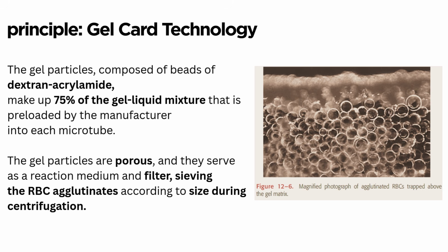So the gel technology plays a crucial role in blood testing by utilizing the properties of gel particles, which are made up of, again, what? Dextran acrylamide gels, or beads. And these beads form a significant 75% of the gel liquid mixture in each microtube, preloaded by the manufacturer.